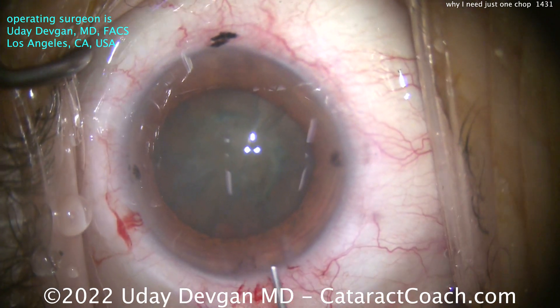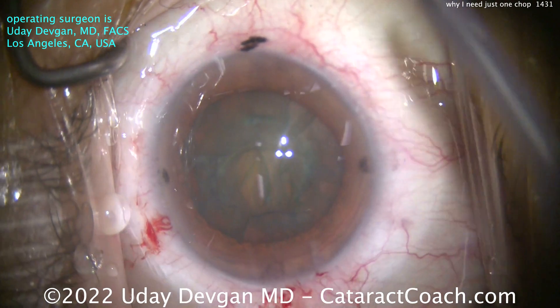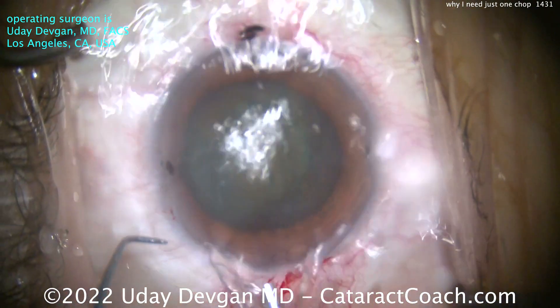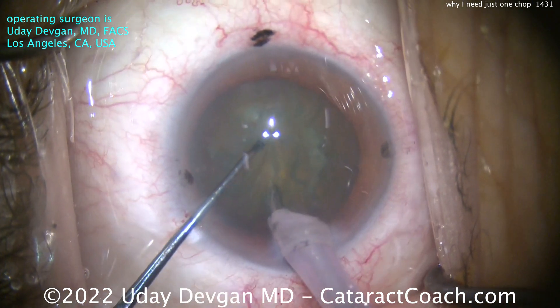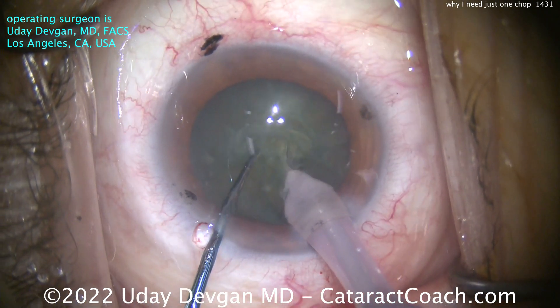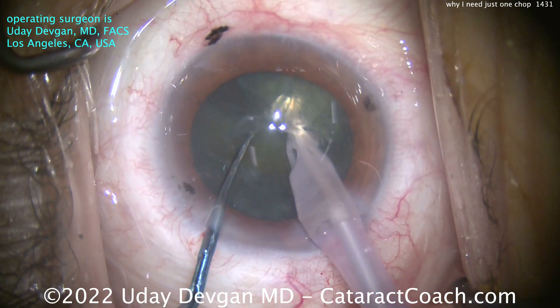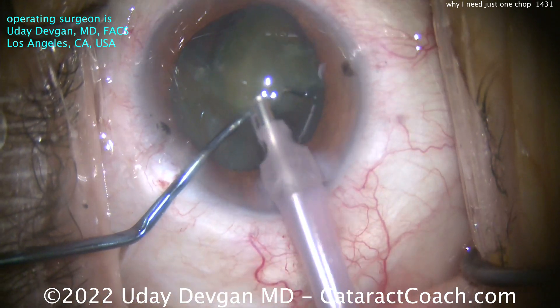Now here comes the one chop. We'll put a tiny aliquot of dispersive viscoelastic on that central cornea. I'm going to go in bevel down and do a combo chop, splitting the nucleus into two halves right away. Phaco probe goes in, chopper goes in. Now watch as the chopper helps split the nucleus — and now the chopper is holding one hemi-nucleus out of the way to create more of a gap.